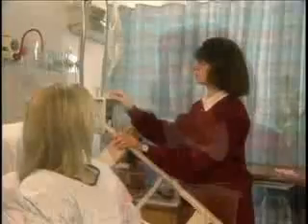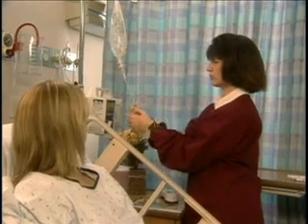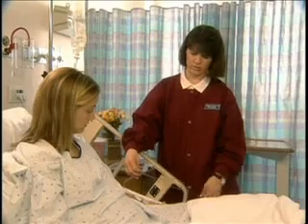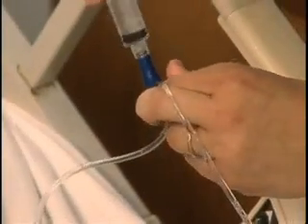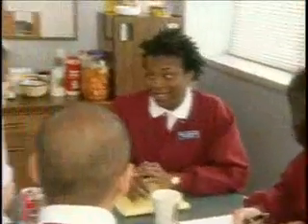What would we do if there were air bubbles in the IV tubing? Well, if the bubbles are above the roller clamp, they can easily be removed by closing the clamp, stretching the tubing downward, and tapping the tubing with your finger so the bubbles rise to the drip chamber. Okay. And if there's a larger amount of air in the tubing, you swab the medication port on the tubing below the air with alcohol. Allow it to dry, then insert a syringe into the port below the air. Using the syringe, aspirate the air from the tubing. Okay, I did not know that.